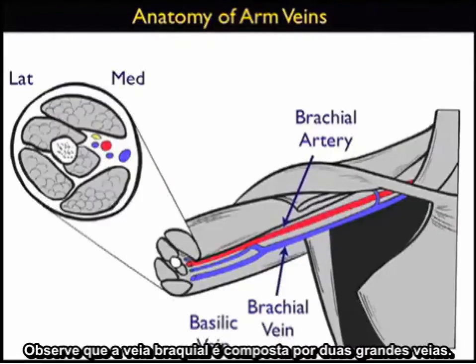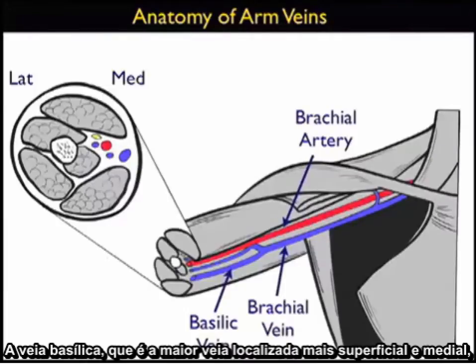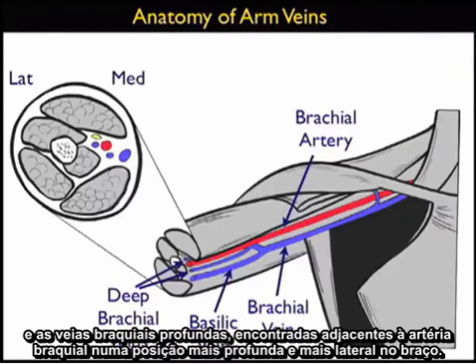Notice that the brachial vein is composed of two major veins: the basilic vein, which is the larger vein located more superficially and medially, and the deep brachial veins found adjacent to the brachial artery in a deeper and more lateral position on the arm.